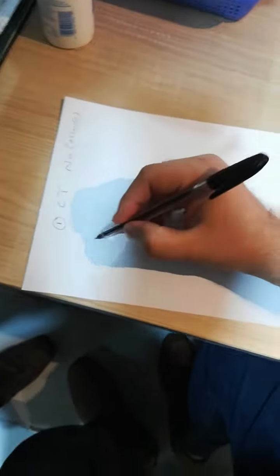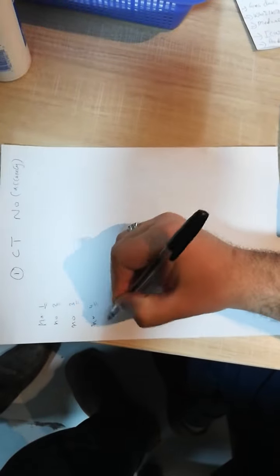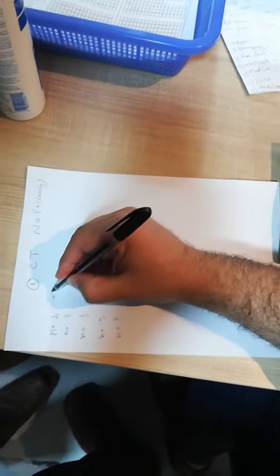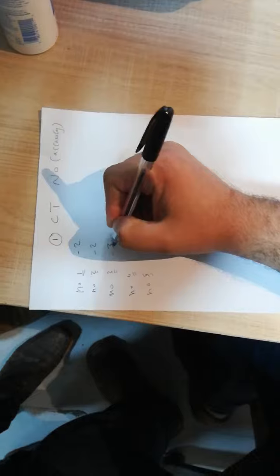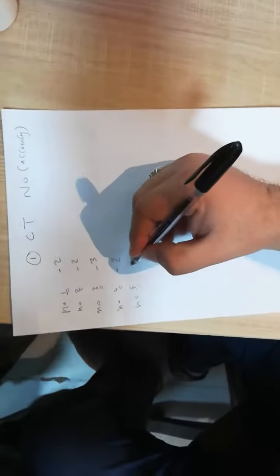I have 5 ROIs, number 1, number 2, number 3, number 4, number 5. For the first one the value was -2, second one -2, third one -3, fourth -2, last one is 0.